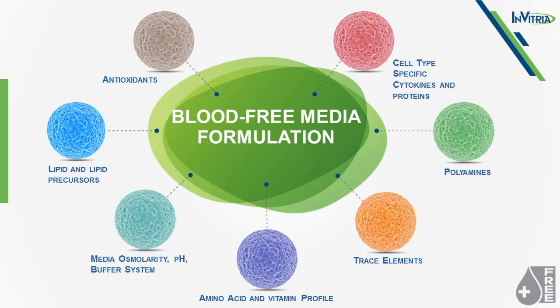Additionally, you'll have to identify the correct cytokine and recombinant protein supplementation, such as insulin, transferrin, and albumin. Finally, you'll also have to consider the optimal pH, media osmolarity, as well as ideal buffering systems in serum-free media.